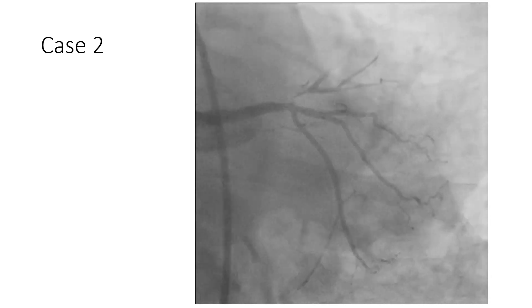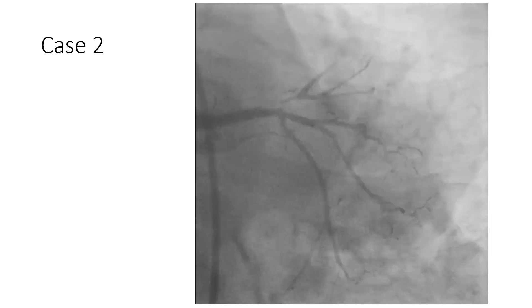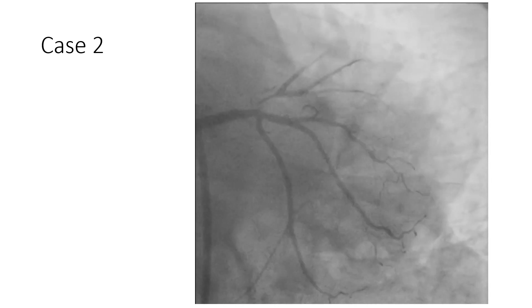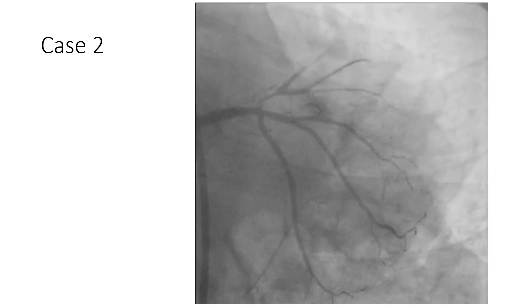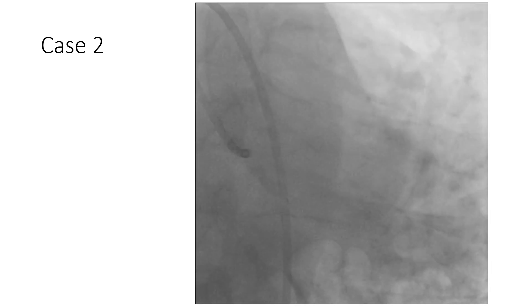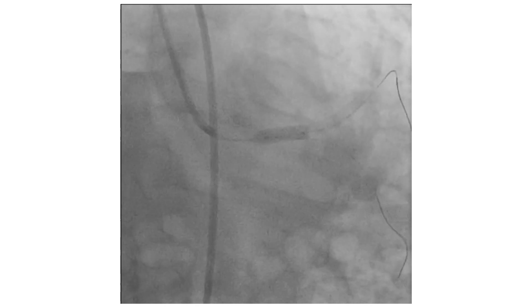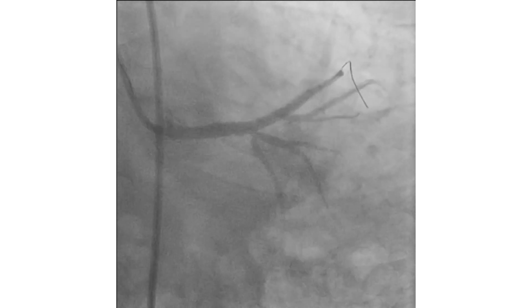Another scenario: in a similar case, we can see a distal left main stem with subtotal occlusion of the LAD. The lesion was pre-dilated and the stent was deployed from the LAD to the left main stem. Recrossing was done, then POT with a larger NC balloon. It is important to position the balloon just proximal to the carina to avoid damage and shifting of the carina. In this case, the side branch appeared acceptable and kissing inflation was not needed.